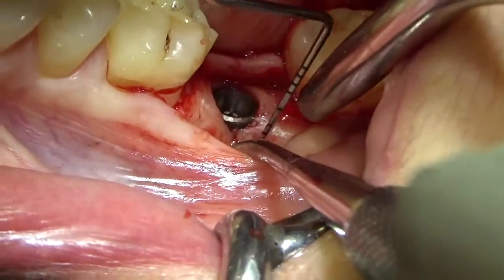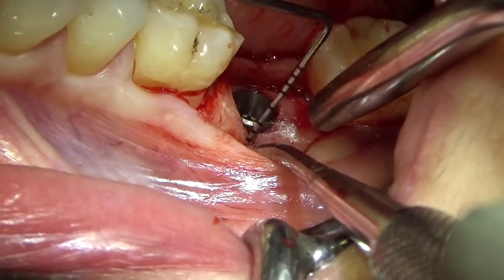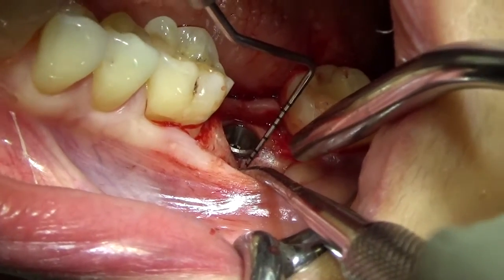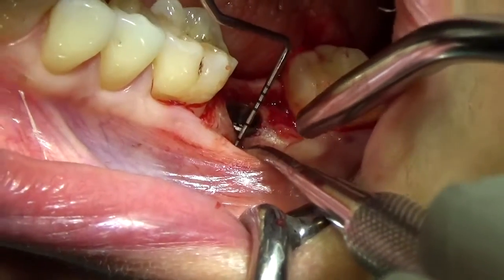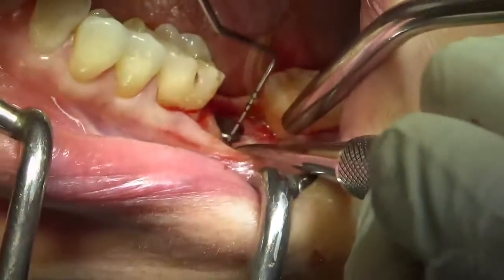So regardless, I would love to build this tissue out here. This is because this is not just a soft tissue defect, this is a hard and soft tissue defect, I'm gonna opt to place a xenograft with a membrane. If this was just a soft tissue defect, this is a good indication for putting something like a connective tissue graft or a fiber guide to bulk out that area.